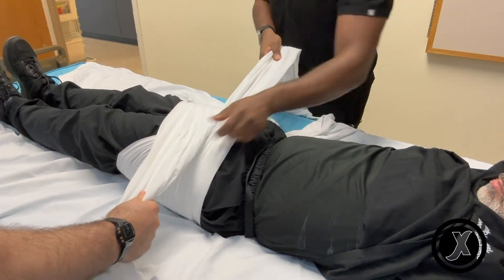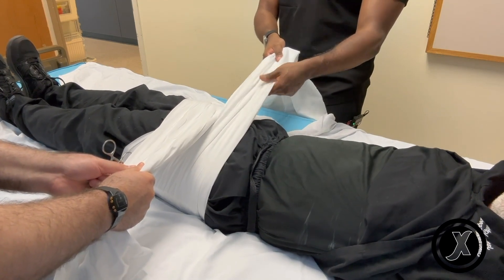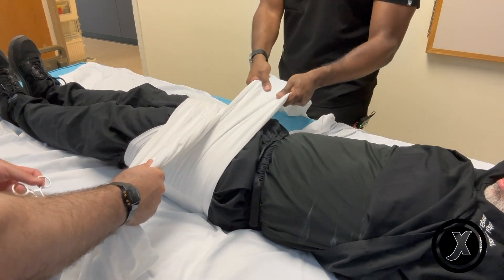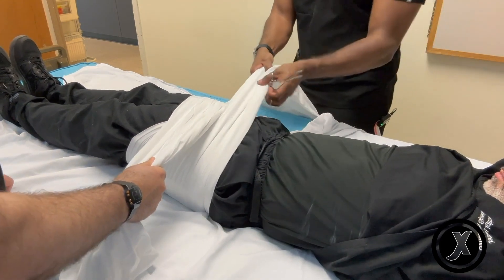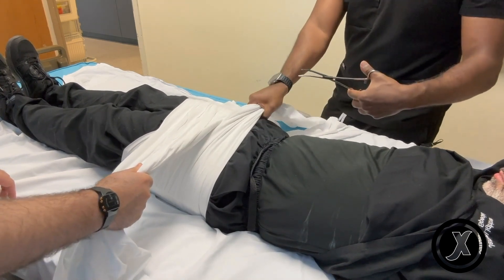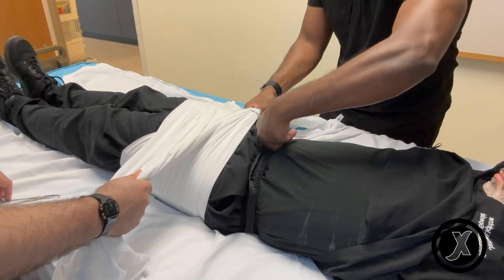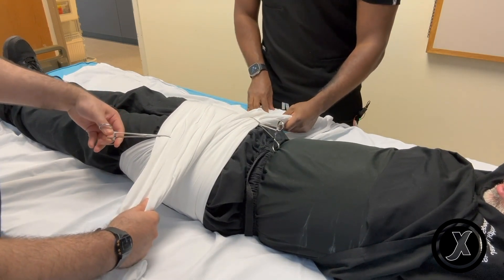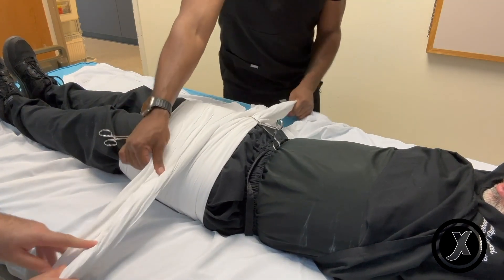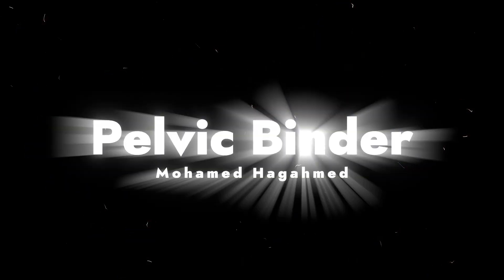And then pull away from each other so that the pelvic space is narrowed and closed. What I like to do is use a hemostat as a way of securing the sheets — use a hemostat here, mindful not to bite the patient. One on each side — making sure it's secure. And there you go.